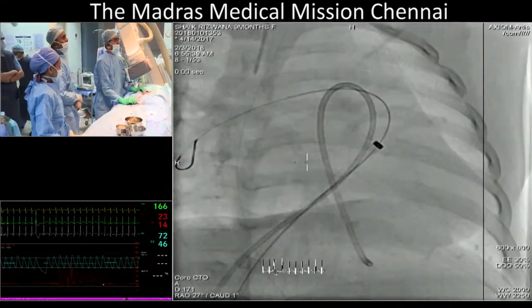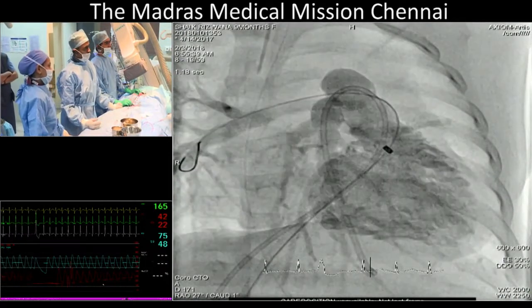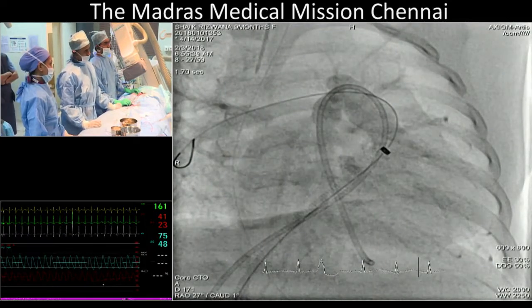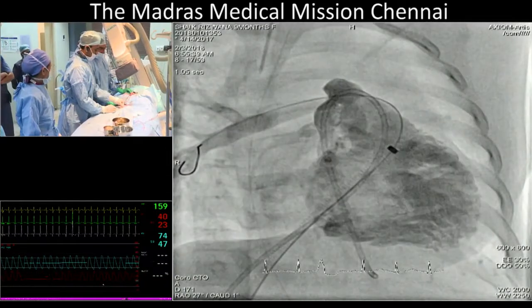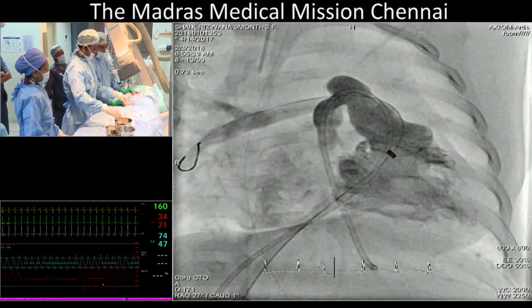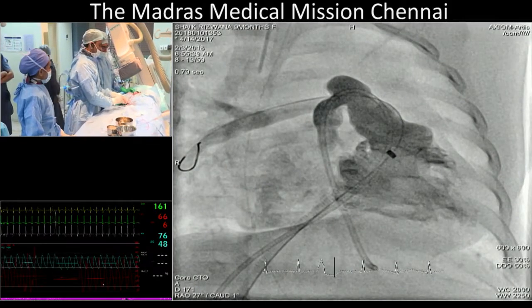My impression is that there is a little bit of improvement in that RPA, and I wouldn't expect massive improvement, but I'd probably accept any improvement without the need for stenting, because stenting creates a different disease which is difficult to treat. So I would be happy.